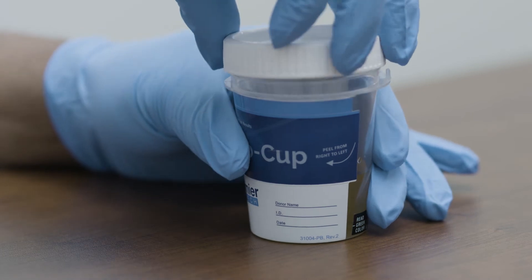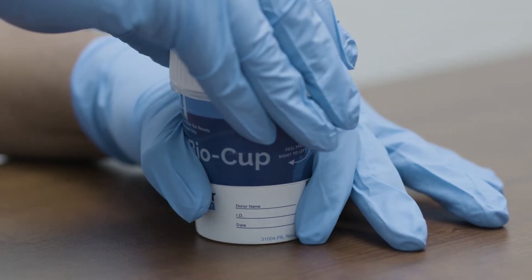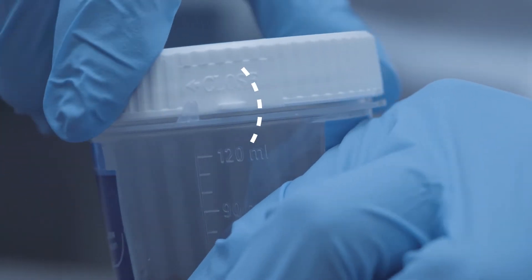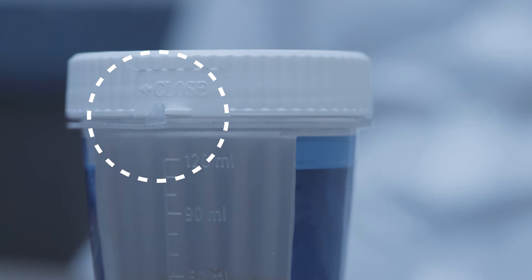After the donor has voided into the cup, replace the lid and tighten it firmly to ensure urine will not leak. The Premiere BioCup has a cap closure indicator as seen here. When the indicated tabs are aligned, the cup is completely sealed.